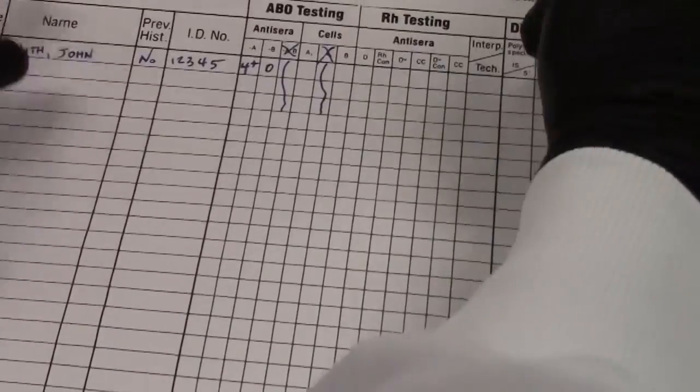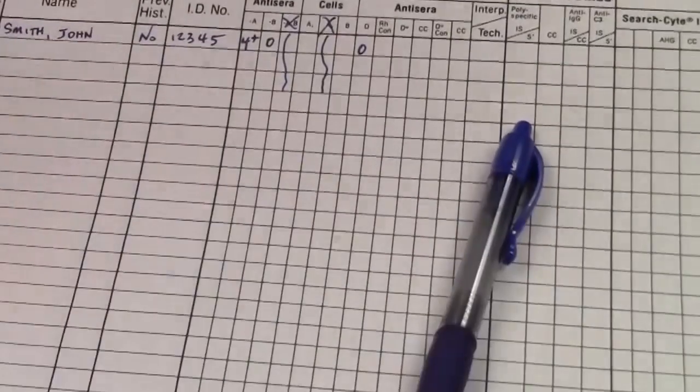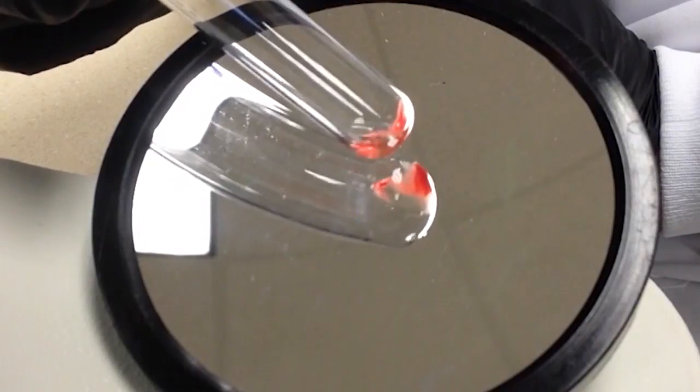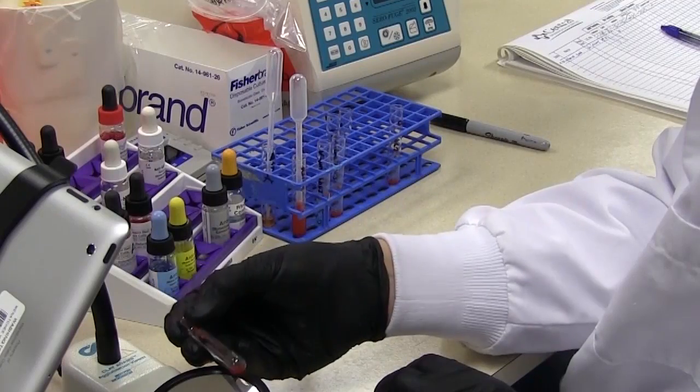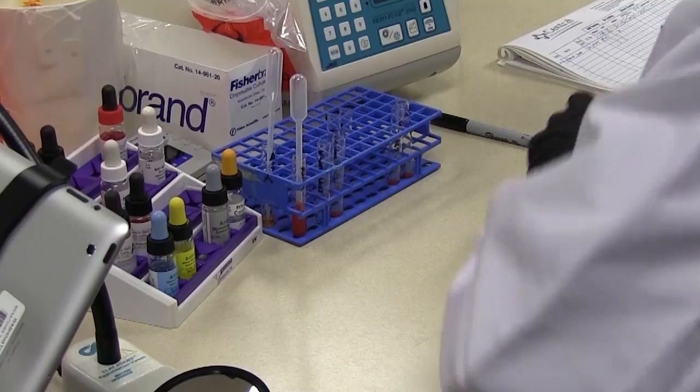Okay our D, once again I don't see any kind of aggregation it looks like a smooth cell suspension. So over here under D we'll record that as zero or negative. Okay let's go ahead and do our control. Okay again smooth suspension so that's negative for the control.